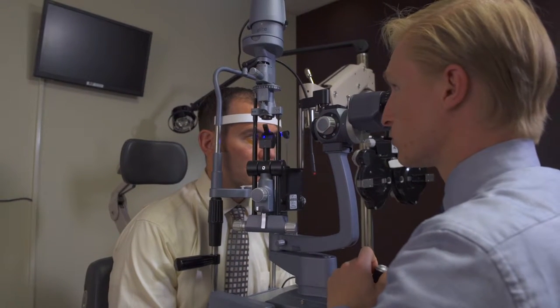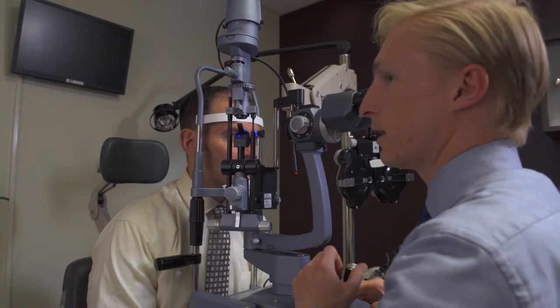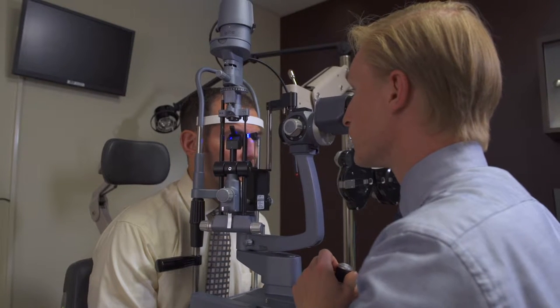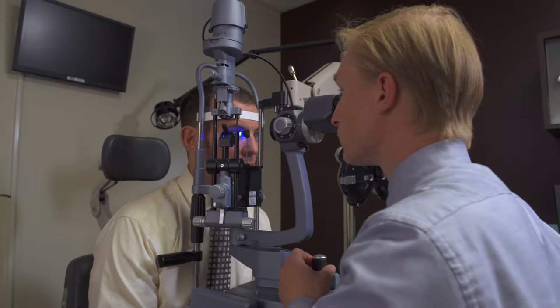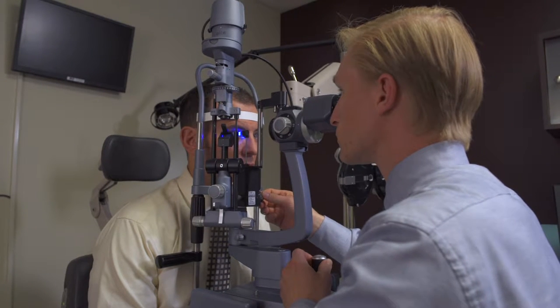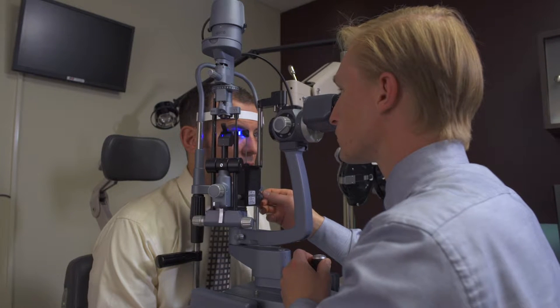I actually like to look through just one of the oculars, leaving my right eye through the left ocular, and sight the patient with my left eye. Then as I move in, I switch over to looking through my right eye to bring into view the mires, adjusting until I see the proper alignment of the concentric circles or half circles.